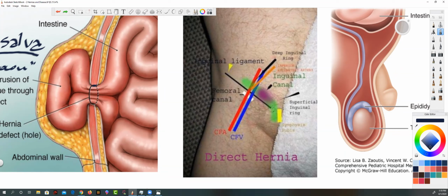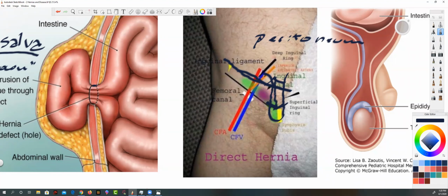So a sagittal image here would be considered a sagittal inguinal canal image. I work my way up until I come to about this level, because up here is the peritoneum, or the peritoneal cavity. In other words, a part of the abdominal pelvic cavity where the intestines are supposed to be. But with this patient, oftentimes I'll have them Valsalva, and I will see fat, maybe intestines come down. And then as soon as they relax, it goes back. If you're able to store a cine loop of that, that's perfect.